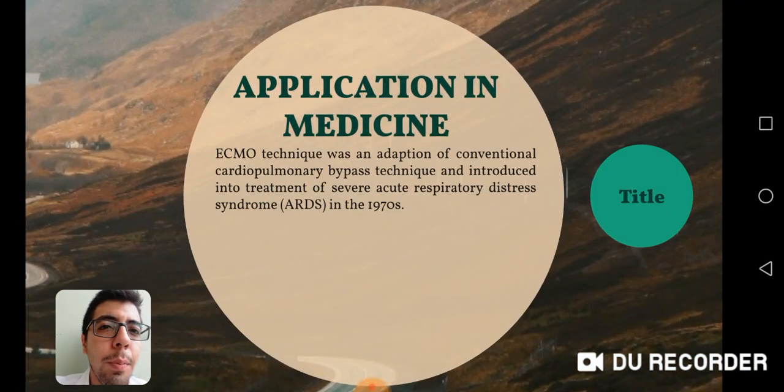Application in medicine. ECMO technique was an adaptation of conventional cardiopulmonary bypass technique and was introduced into treatment of severe acute respiratory distress syndrome in the 1970s.